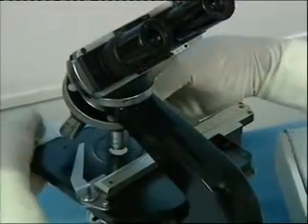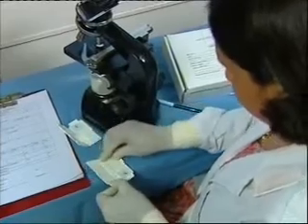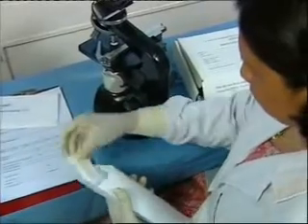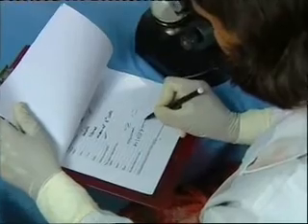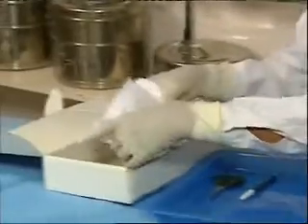After completion of the microscopic examination, the cover slips are left in place and the slides placed into carriers. The carriers are shut and placed in the right envelopes. The history of physical form is then completed, showing the results of the microscopic examination. Sketches of trauma or other physical findings are completed. The envelopes are then initialized and placed in the bottom of the kit.